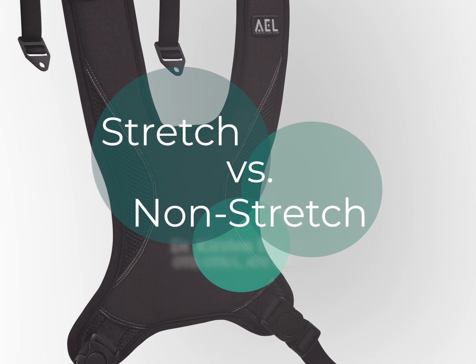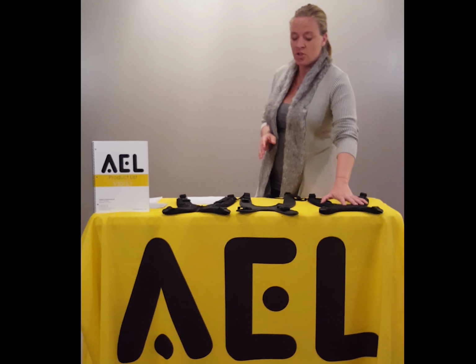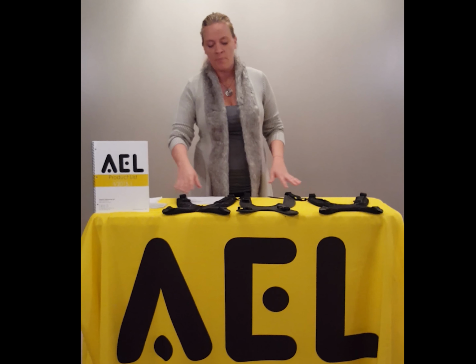After attempting to ensure neutral or as neutral as possible pelvic positioning, we can then move on to the anterior support option. Now, after deciding whether slim cut or standard cut is the best option for your client, it's time to determine whether a stretch option, a non-stretch option, or a zippered design is in your client's best interest. There are some key differences between the stretch, the non-stretch, and the zippered design.